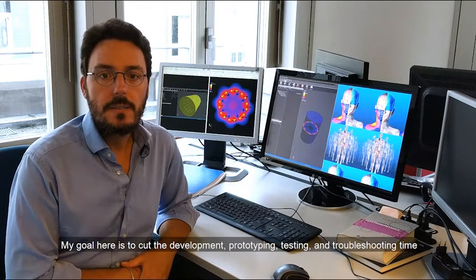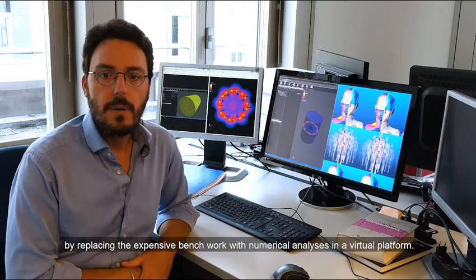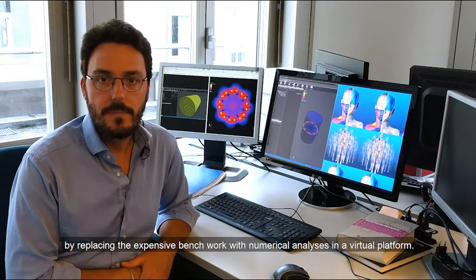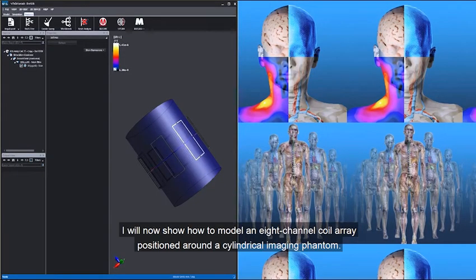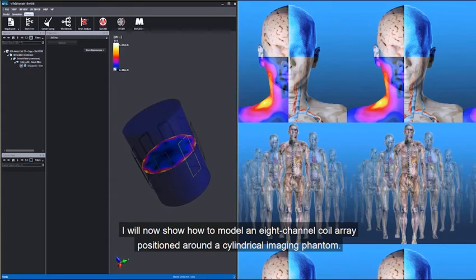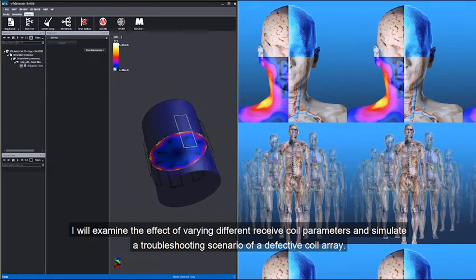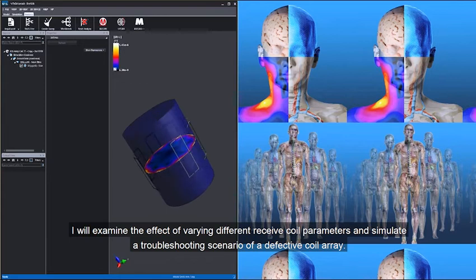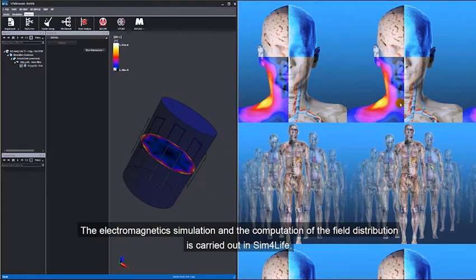My goal here is to cut the development, prototyping, testing, and troubleshooting time by replacing the expensive benchwork with numerical analysis in a virtual platform. I will now show how to model an 8-channel coil array positioned around a cylindrical imaging phantom. I will examine the effect of varying different receive coil parameters and simulate a troubleshooting scenario of a defective coil array. The electromagnetic simulation and the computation of the field distribution is carried out in Sim4Life.